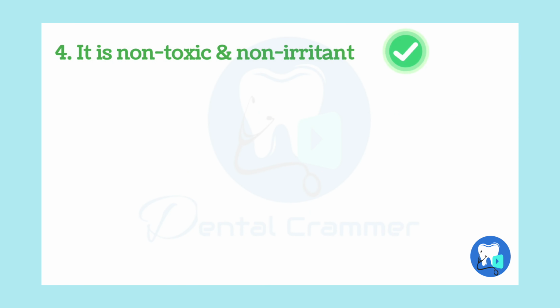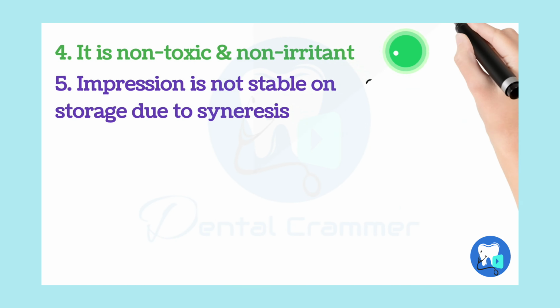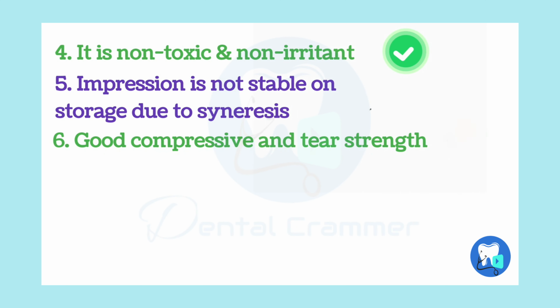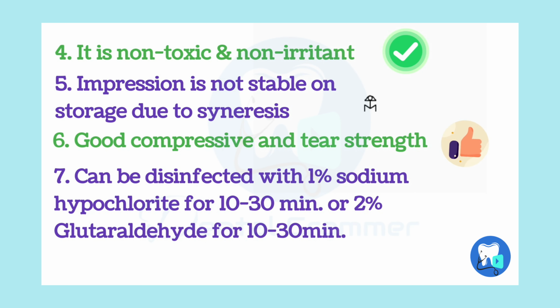It is non-toxic and non-irritant. But the impression is not stable on storage due to syneresis, and when placed in water, it causes imbibition. Syneresis and imbibition are discussed in the previous video. It has good compressive and tear strength. It can be disinfected by 1% sodium hypochlorite or 2% glutaraldehyde solution.